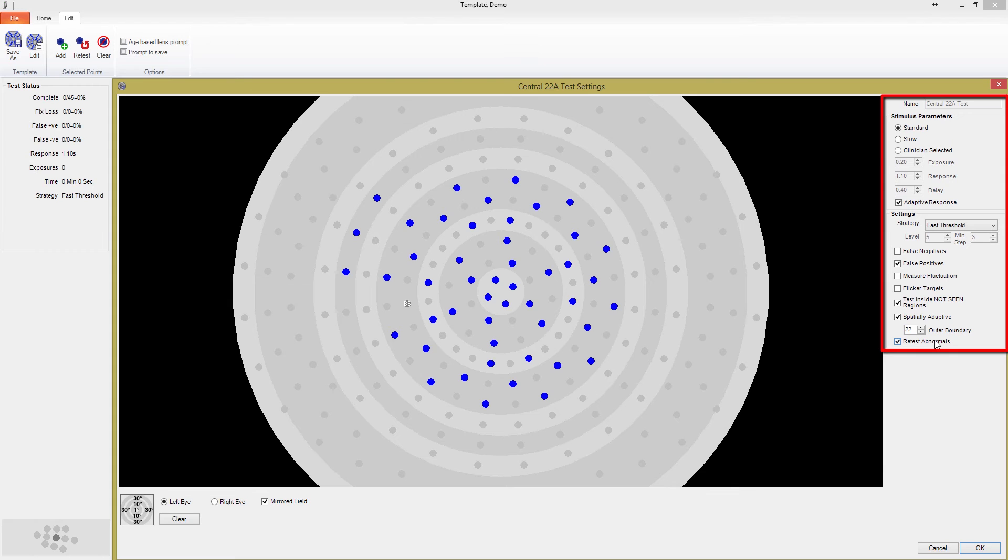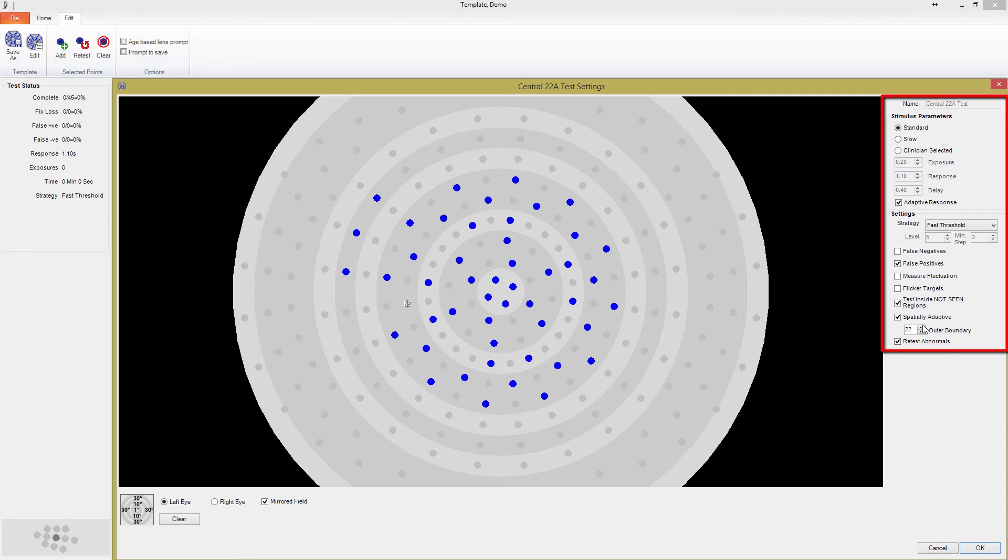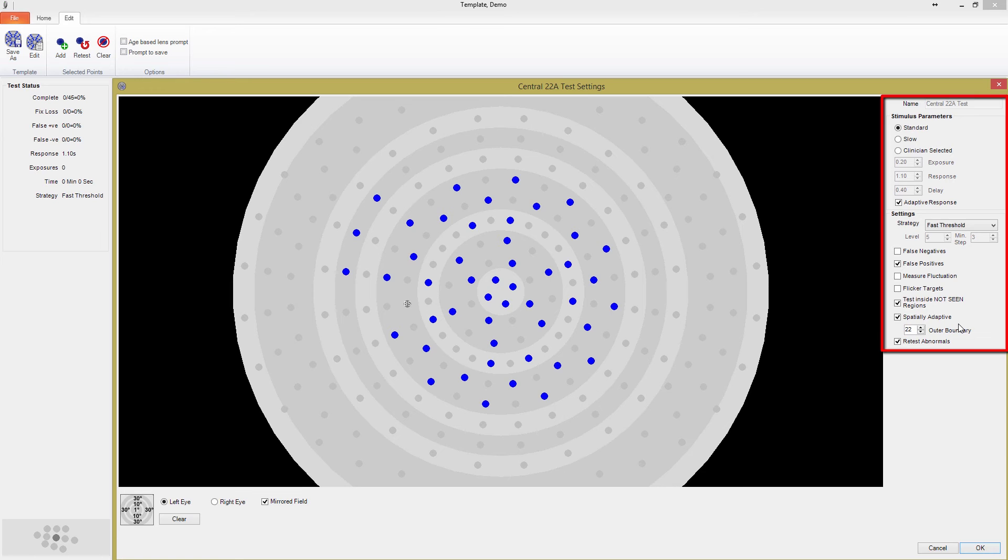Finally, let's go back to the box I skipped. The Spatially Adaptive feature is my personal favorite and allows you to build very powerful thresholding tests. With Spatially Adaptive turned on, when a point completes, it is checked against the age normal values for that patient at that location. If the threshold is depressed by greater than 6 decibels, all of the surrounding points that have not been selected in the test template are added to the test.